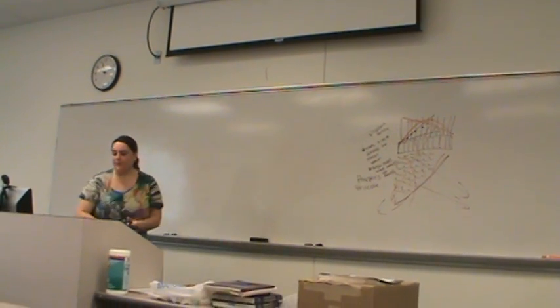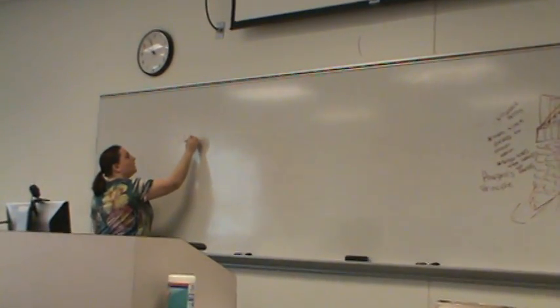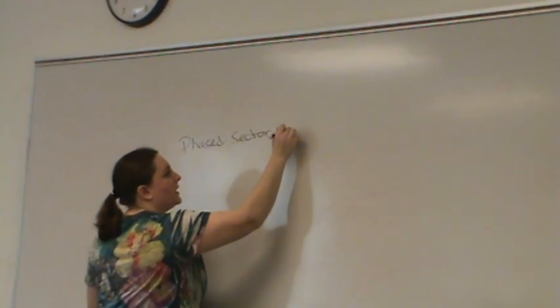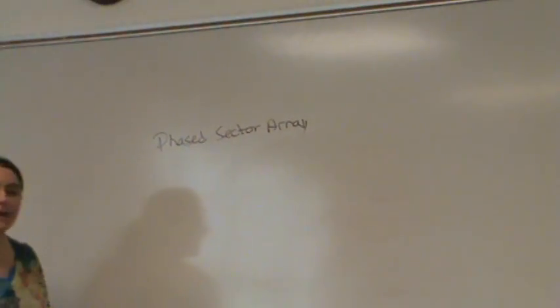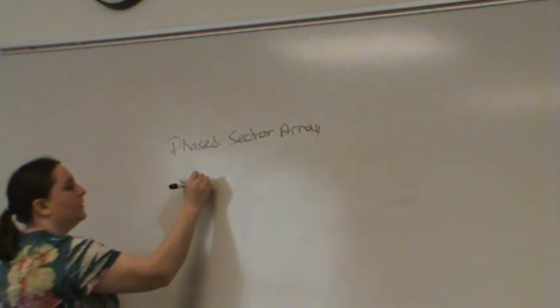But we have something called the phased, often called a sector array. So this is the one that has the small footprint.